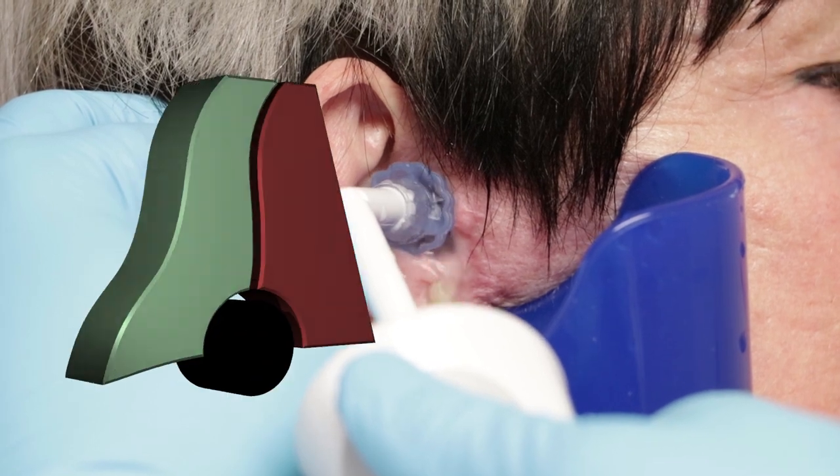Hey guys, thanks for joining us. Sharon needs her ears cleaned. This one on the right more so than the left, but they both do show there's wax in them — quite a bit, just more on the right.